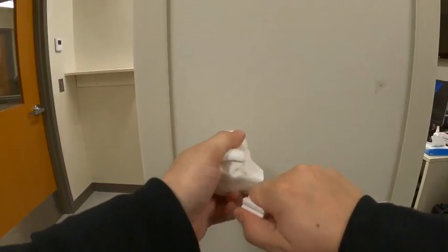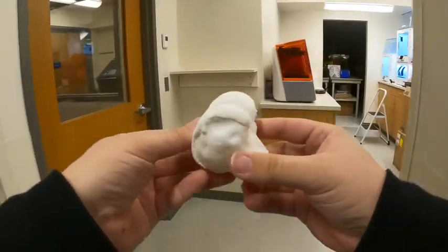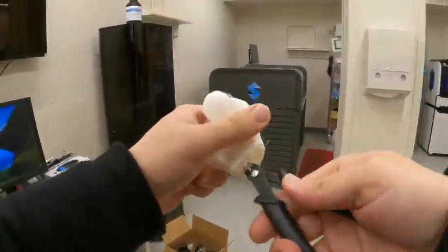Models were printed using material extrusion 3D printing technology on an Ultimaker S5 printer. After printing, the support structures are manually and carefully removed and post-processing is performed.